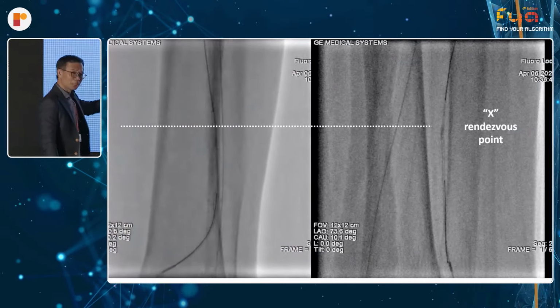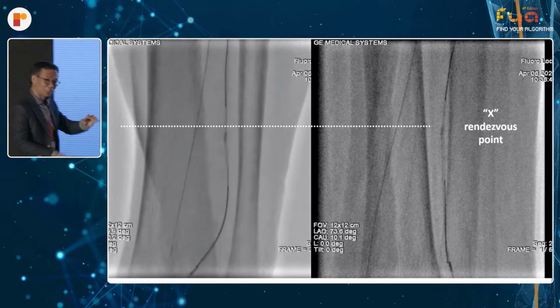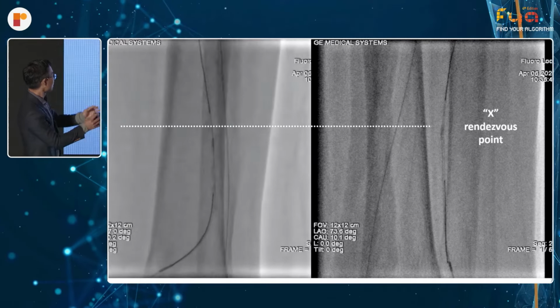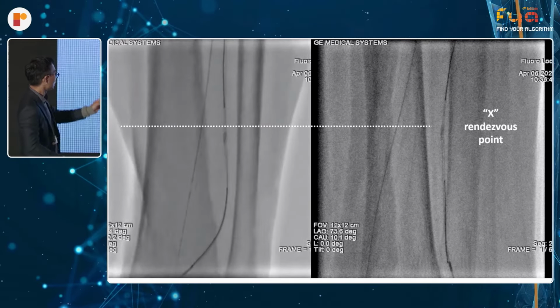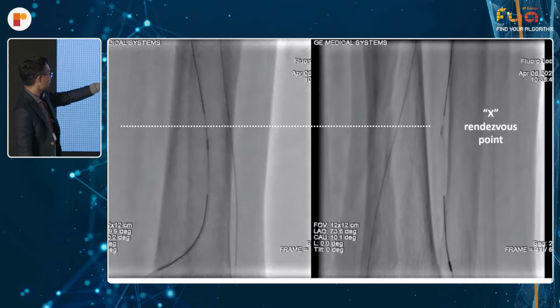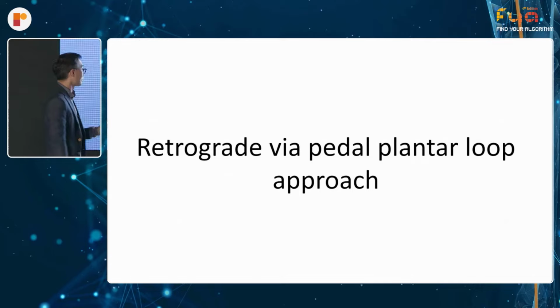It also can be used for BTK lesions as well. It's a little bit more subtle, but you can see some parts the wires are diverging, some parts the wires are crossing each other, but where it crosses, that's the point where you will always go into it.